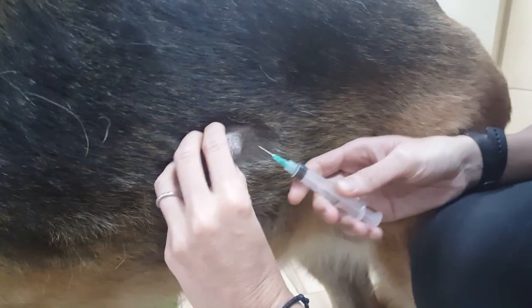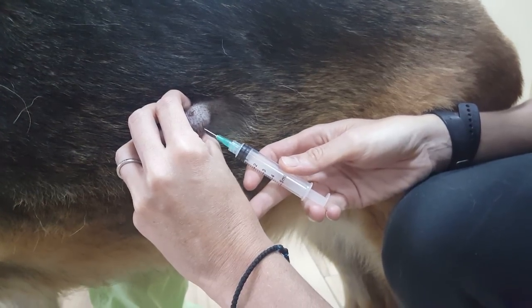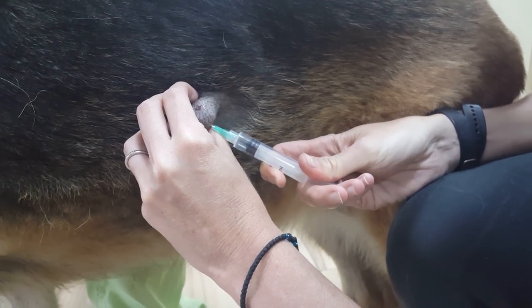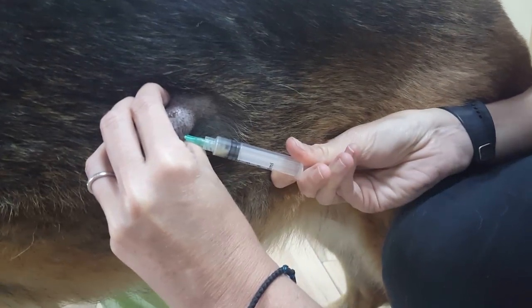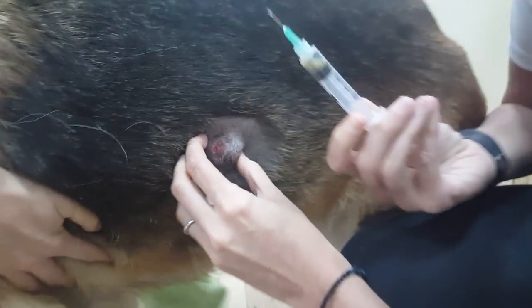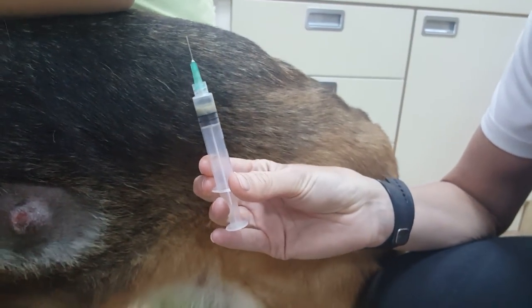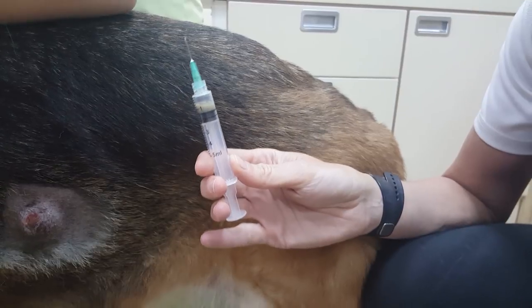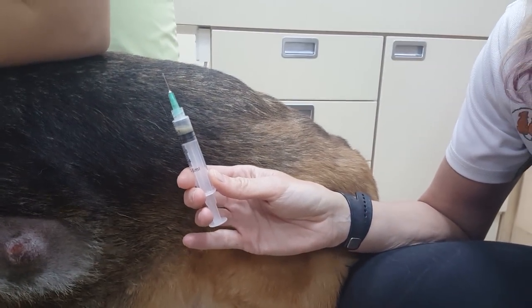We're going to just hold it there, and then we're going to go in. I'm into the lesion, and I'm just going to move it around a little bit. Now we can see we've got some liquid coming out of here, and that doesn't look very nice. So what we're going to do is smear that out on a slide and take a look at it.